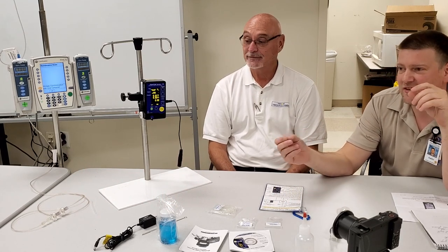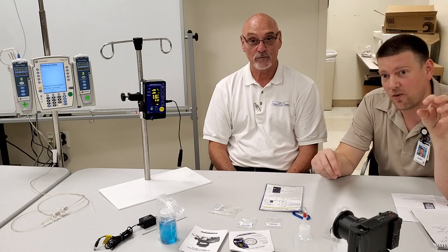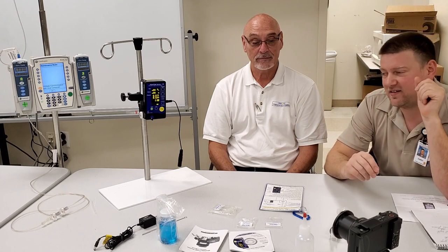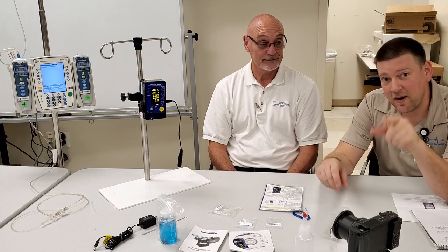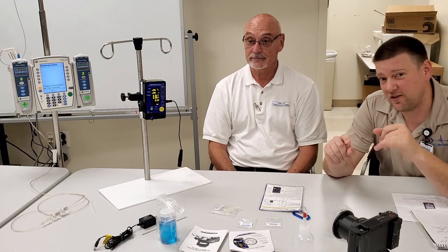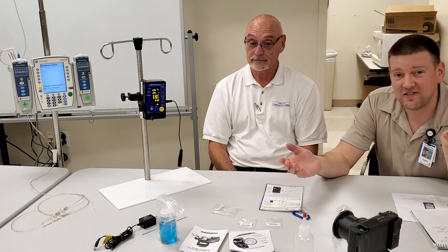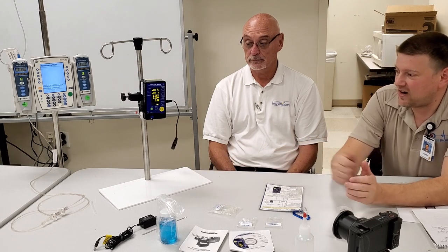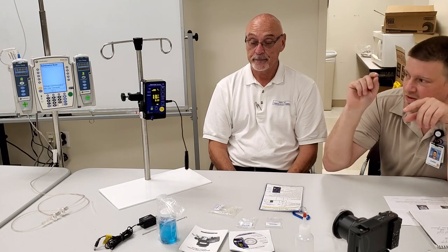You could actually use this to test line pressure — plug it right into your wall if customers say they don't believe the gauges or aren't getting enough pressure. One of the highest pressure applications we test is pneumatic tourniquets, which go up to about 700–750 millimeters of mercury — only about 16 PSI. This device goes to an insane level beyond that, and you can check temperatures too.